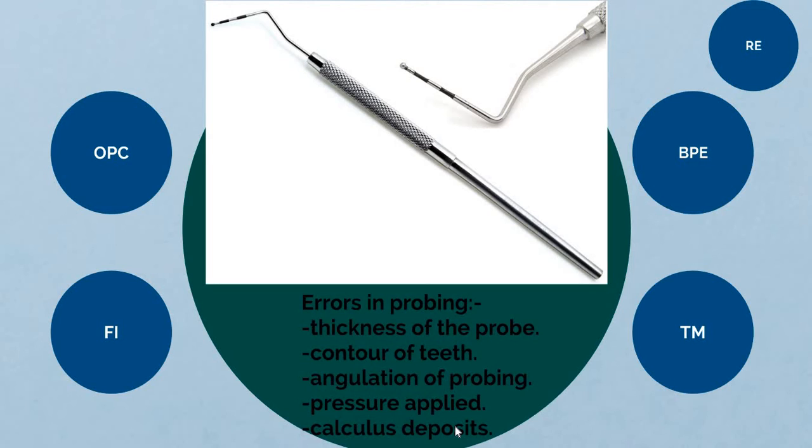The loss of attachment is easier to measure when there has been gingival recession and the cemento-enamel junction is visible. But if you have no visibility of the cemento-enamel junction, you may face some difficulty. That's why specialized probing methods need to be undertaken. When patients are being monitored longitudinally before and after treatment, sequential attachment level measurements can be made relative to a fixed point.